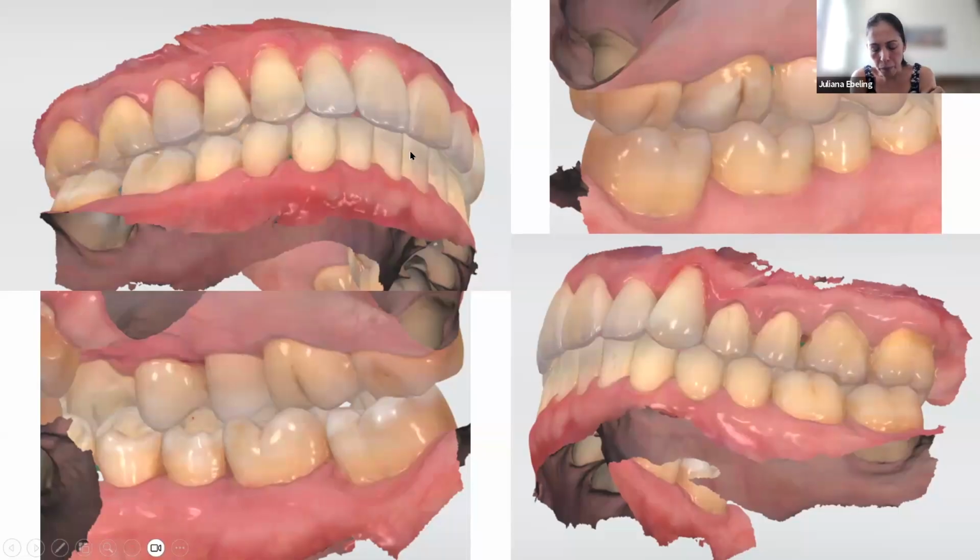And it's very important. Even if I have some not perfect contact distribution during this composite adding, this reanatomized phase, because we do one here and one here. It's a lot of work to rebuild this occlusion.